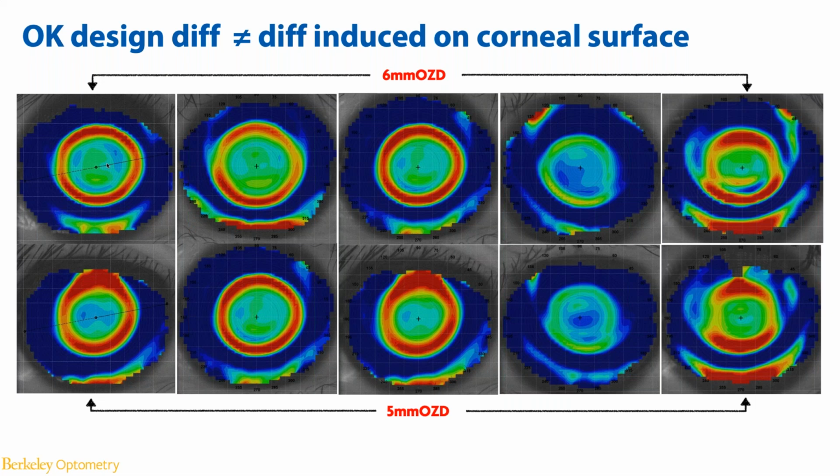And another practitioner is actually looking at the slide you have up now, and they have a question about the images, the 4th image in both rows. They're wondering why this image looks completely different from the others. So this subject, number 1, she had a flat cornea to start with.